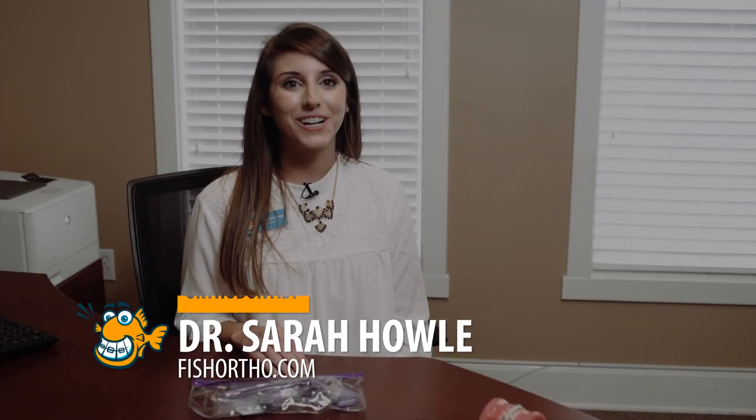I'm Dr. Sarah Howell with Fishbein Orthodontics and today we're going to cover proper brushing techniques for braces. Let's start with a brief overview of your appliances as well as the tools you'll use on a daily basis.